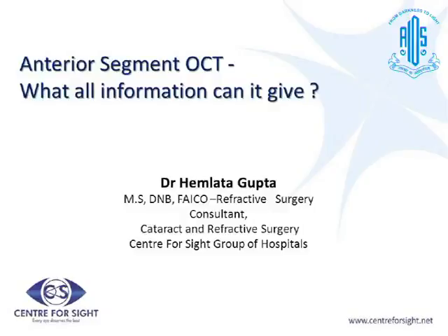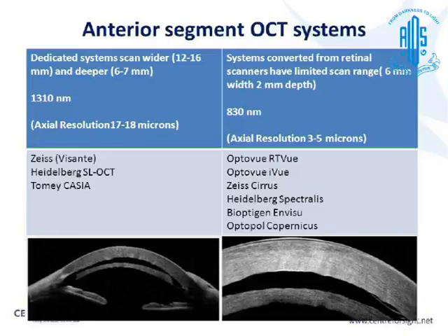Good afternoon, everybody. I'll be talking about the clinical applications of anterior segment OCT. There are many anterior segment OCT systems available in the market, and each design has its own distinct advantages. Mainly, there are two types, the dedicated anterior segment OCT systems and the systems converted from retinal scanners.